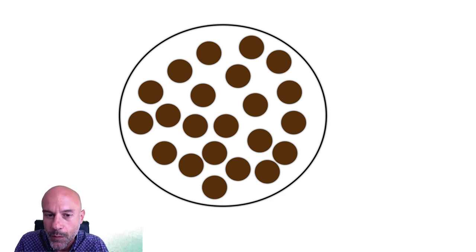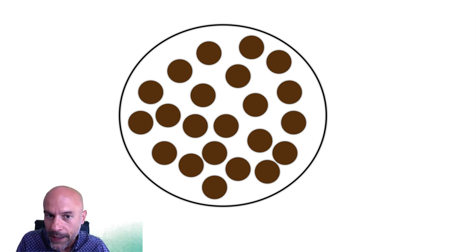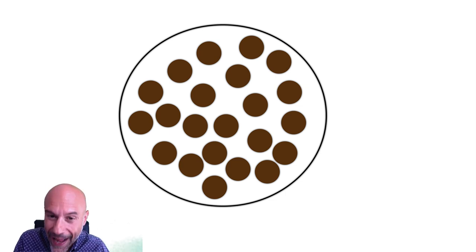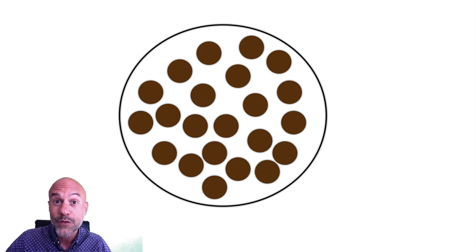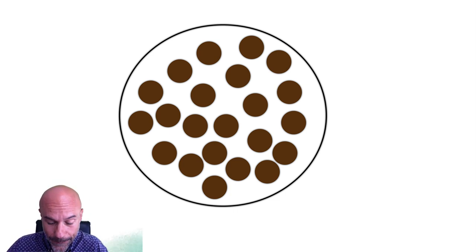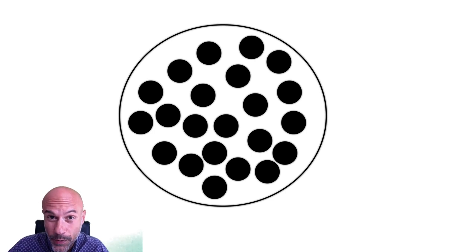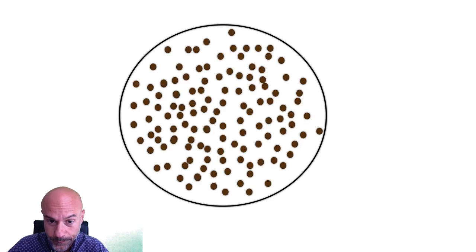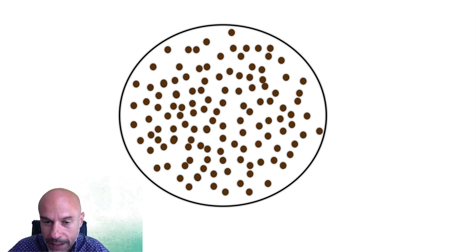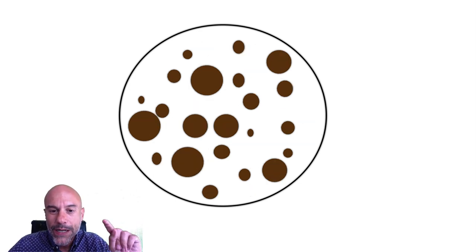Here you can see multiple brown globules — are they typical or atypical? They are regular because they have the same color brown, more or less the same diameter, and are regularly distributed in the lesion. Or the next example: black globules, regular — yes, for the same reasons. Next example: brown dots — regular, because they are the same size, same color, and regularly distributed.